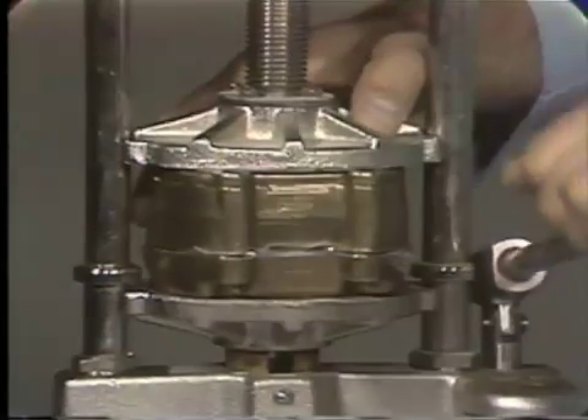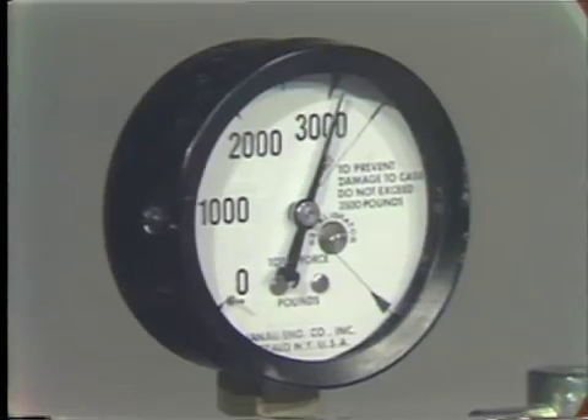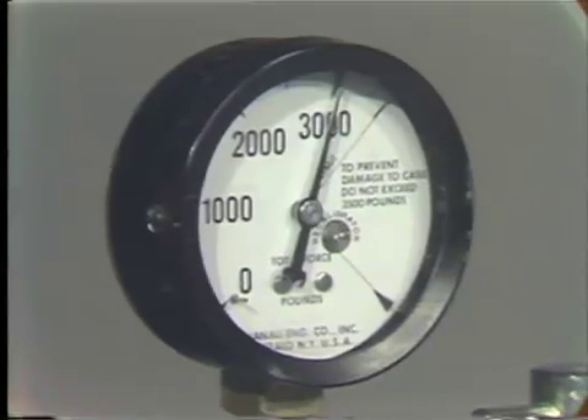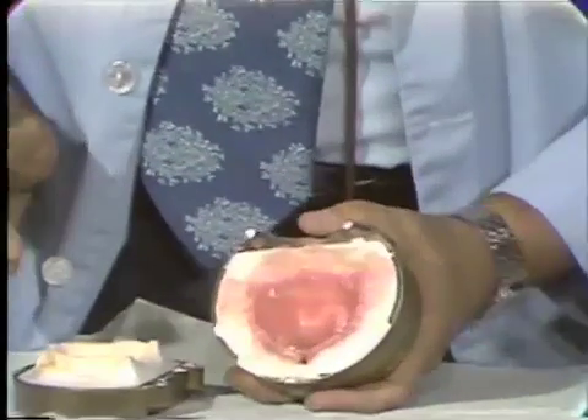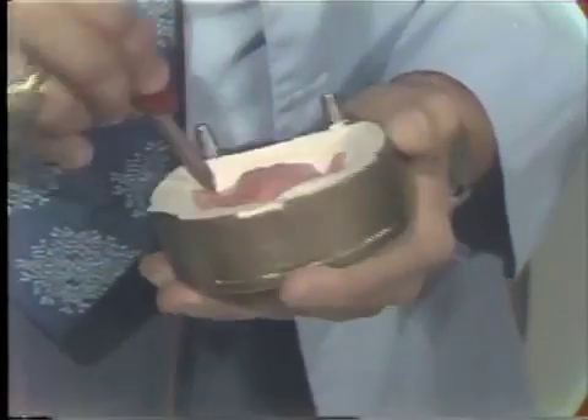Again we will go up to 2,000 or 3,000 psi. It's good to hold it at this point for a moment or two to allow the material to flow. We release the pressure and retrieve our maxillary flask, and again you will see a tremendous amount of flash from the second packing. Now if we were to leave this we would be inadvertently increasing the vertical dimension of our clinical case and also distorting the occlusal relationships we were so careful to establish. Therefore we go back and actually trial pack two to three times generally, continuing until we no longer see flash of any appreciable amount within our flask.